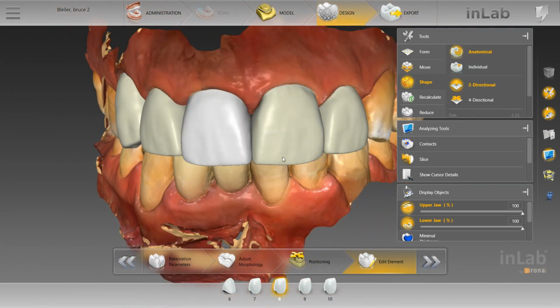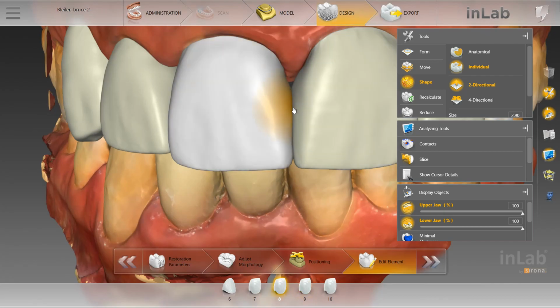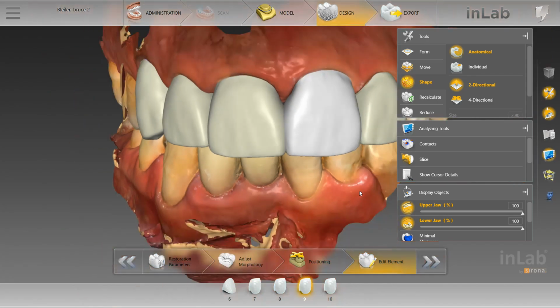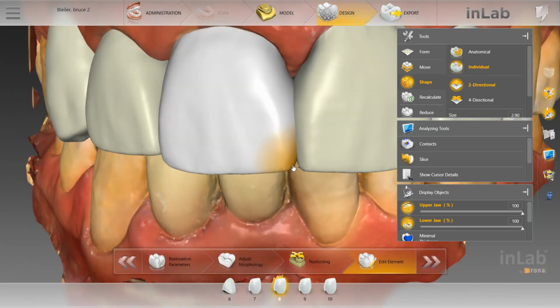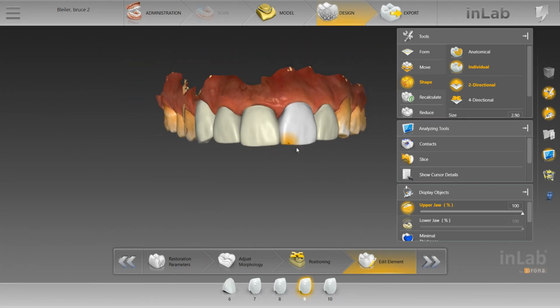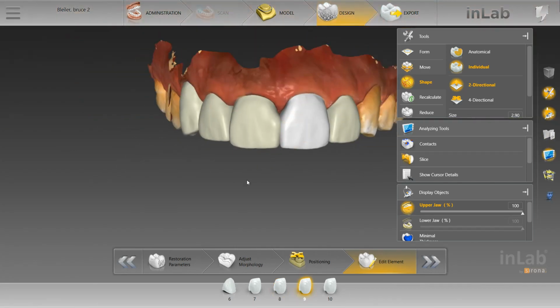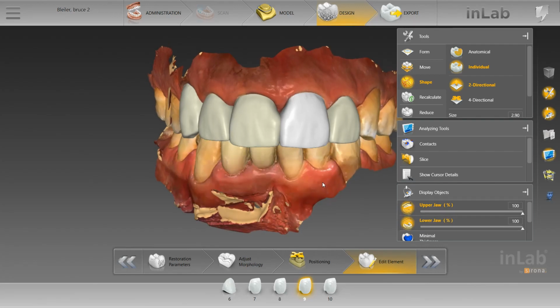So let's do this. We're going to take the shape tool and make this midline less than ideal. Let's add a couple lumps, a couple bumps, throw it off completely. To some of you this may not look all that bad, but you'll still be able to grasp the idea of the technique we're going to use. We'll just really throw it off. Say this is the midline you've got.